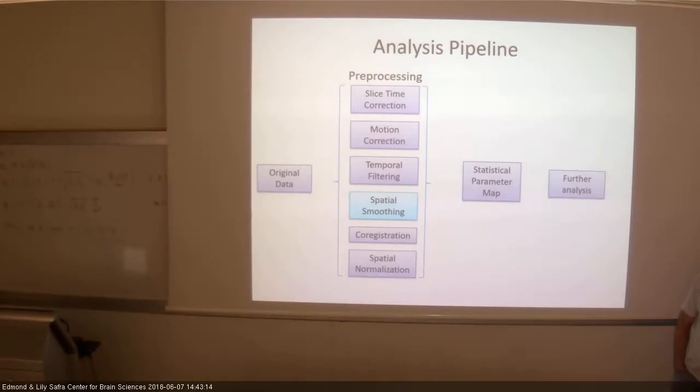And you want to first be thoughtful about what you remove. So you usually remove, at least automatically, only the low frequencies. But we'll get to that in the second half today about designing your blocks, events, and so forth. For example, when you design a block, you want it to be not too long and not too short, for different reasons.